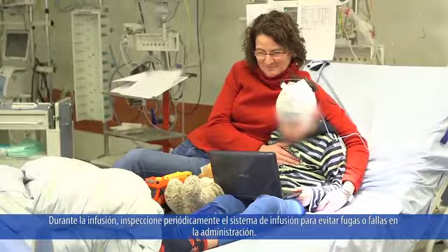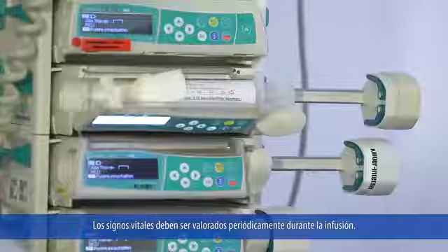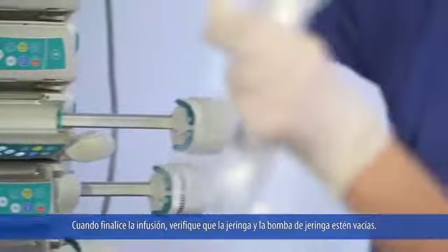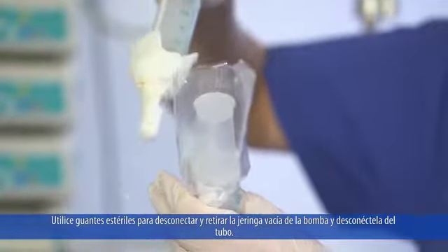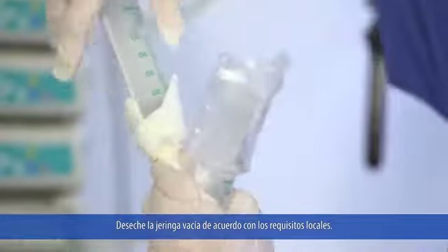Throughout the infusion, periodically inspect the infusion system for signs of leakage or delivery failure. Vital signs should be monitored periodically during the infusion. After the infusion is complete, check that the syringe in the syringe pump is empty. Wearing sterile gloves, detach and remove the empty syringe from the pump and disconnect it from the tubing. Discard the empty syringe in accordance with local requirements.